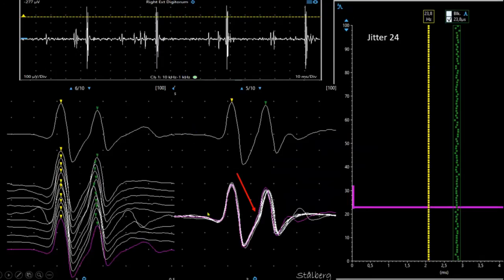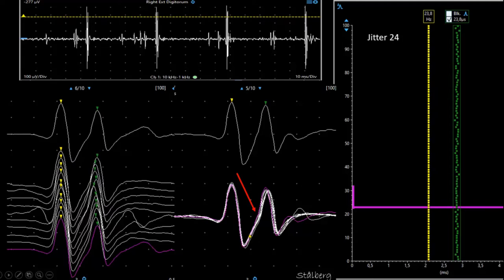Here we have another signal with triggering on the first one and visible variability. There is obviously a summation of activity from two muscle fibers. The inflection point is at about half the signal amplitude or below the 50% level, so we can accept it. Had the inflection been higher, we would skip this recording, but this one is acceptable.